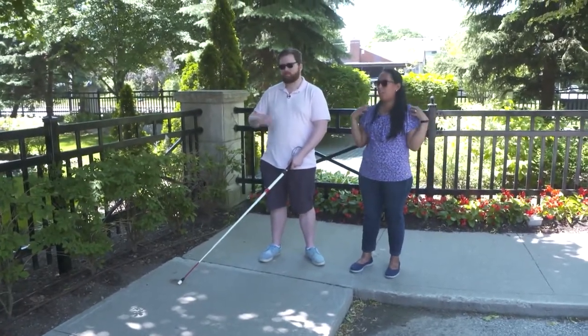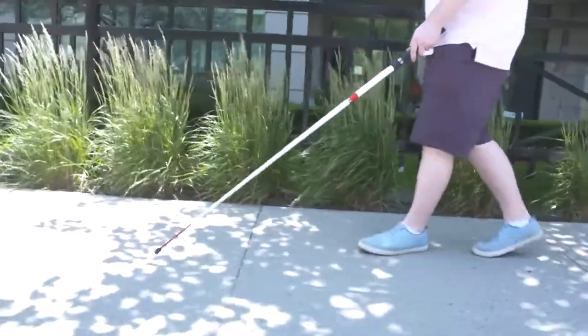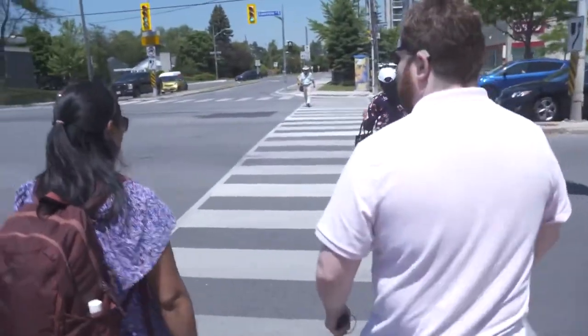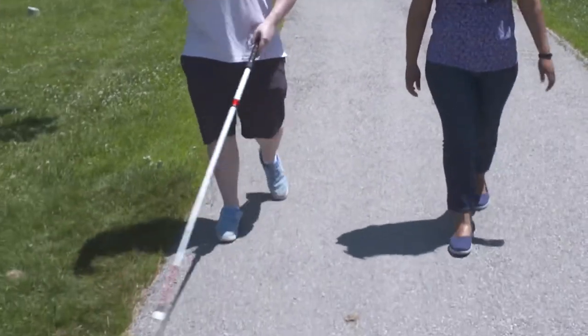Anita Laurinaitis: This is to make sure you're clearing your space in front of you. After a few instructions and a quick practice walk, they took to the sidewalks and trails on a beautifully sunny day, starting along a paved path where Anita explained the idea of shorelining.